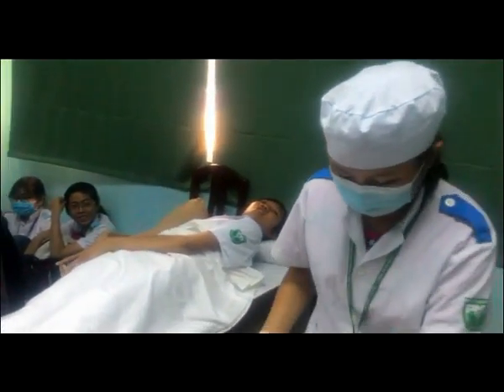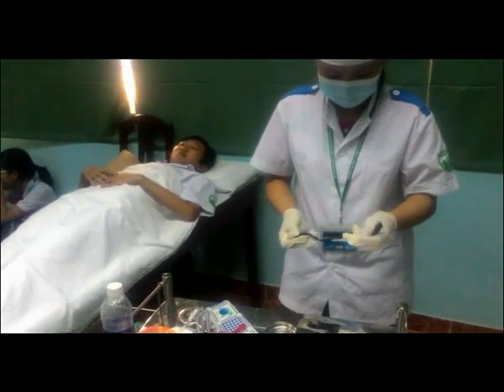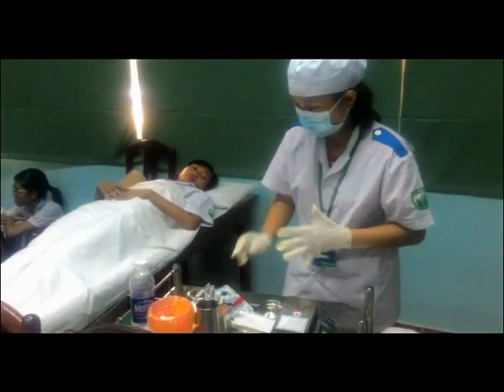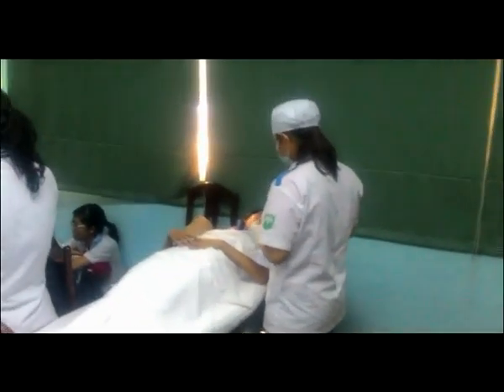Thu dọn dụng cụ, trả bệnh nhân về tư thế tiện nghi. Tháo găng tay và báo bệnh nhân biết đã tiêm xong.